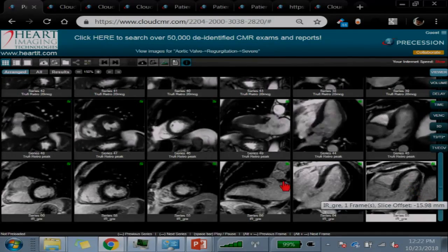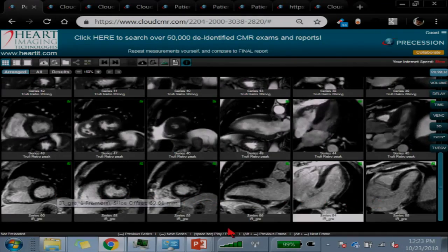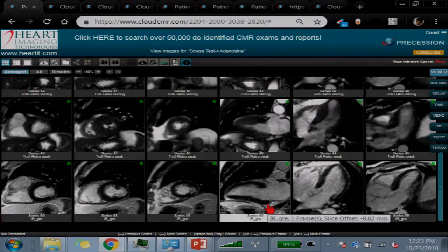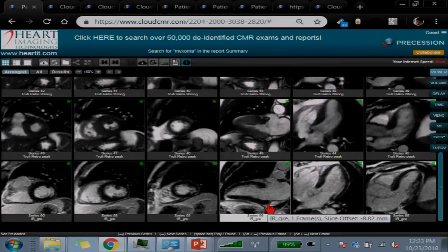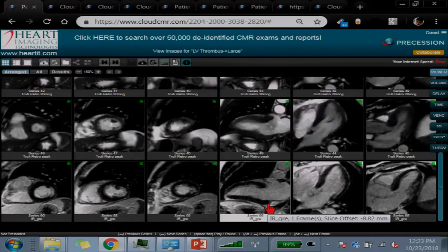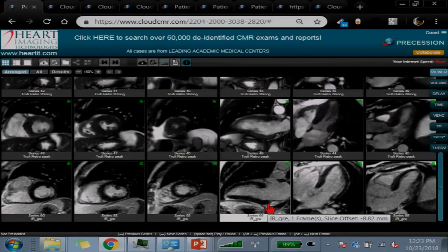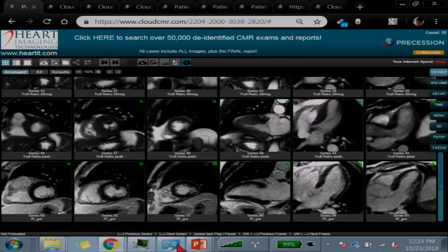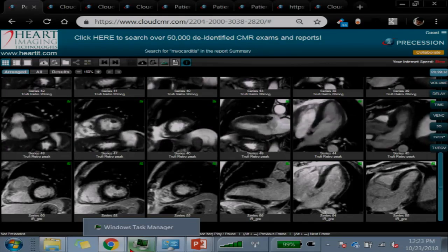Okay. And shown down below here is the delayed enhancement. And what do you guys see on the delayed enhancement? Yes, so there's a subendocardial infarct in the lateral wall. So this patient clearly has CAD, and now is evident, although we picked that up on the dobutamine without contrast. Okay. This is an example of a patient that's being evaluated for CAD using dobutamine.